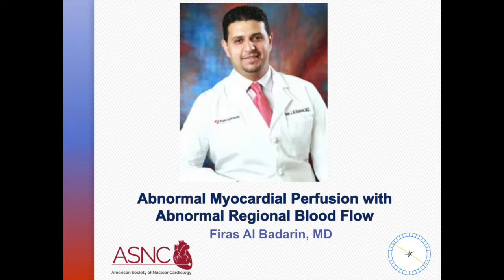Being an inpatient, you would want a modality that will provide you with reliable answers, be able to inform subsequent management of the patient, either further invasive evaluation or discharge. And ideally, you would want to get information about longer-term prognostication for the patient. Among the available modalities, vasodilator PET happens to fulfill most of the conditions I mentioned earlier.